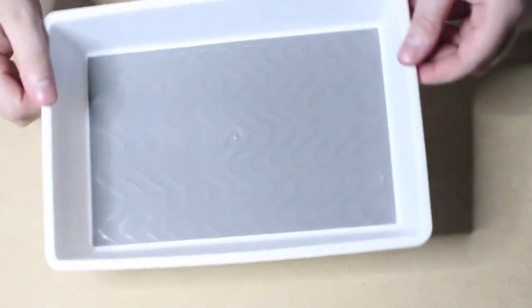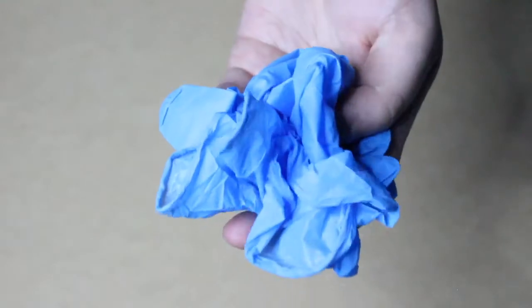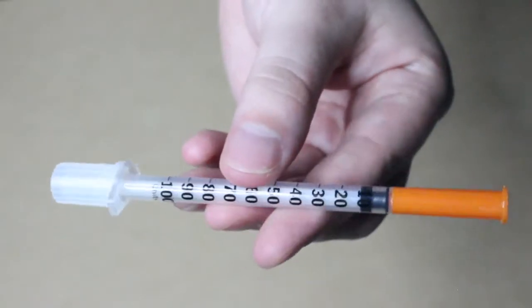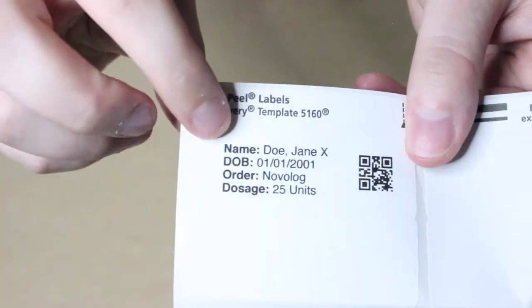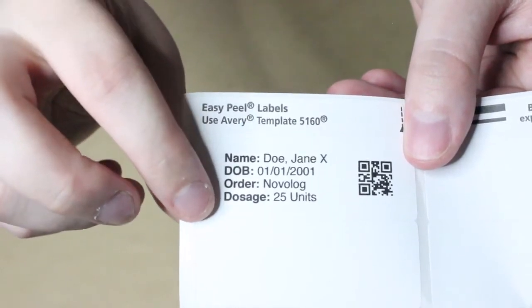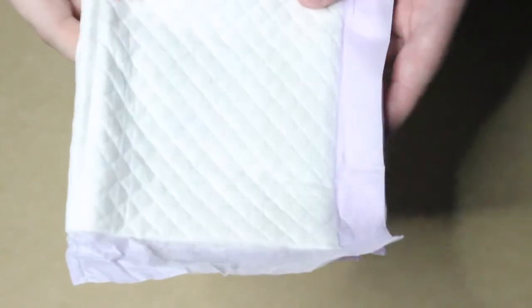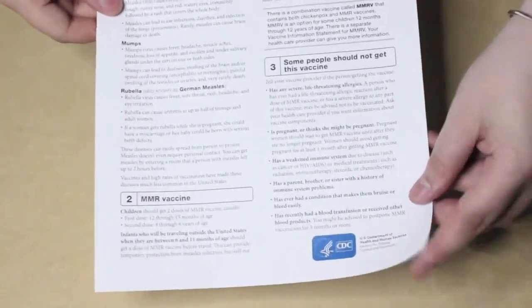Moving on to supplies, you will need a basket or tray to place all your supplies in for transport, the order from the provider, disposable gloves, the correct medication, the appropriate sized needle and syringe, alcohol swabs, gauze squares, a band-aid, a printed label that has the patient's name, date of birth, the medication name, and the medication dosage, a chuck to place all of your supplies on while in the room, and if you are administering an immunization, you also need a VIS sheet from the CDC.